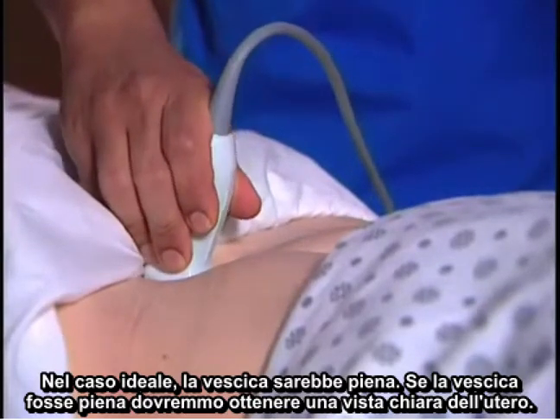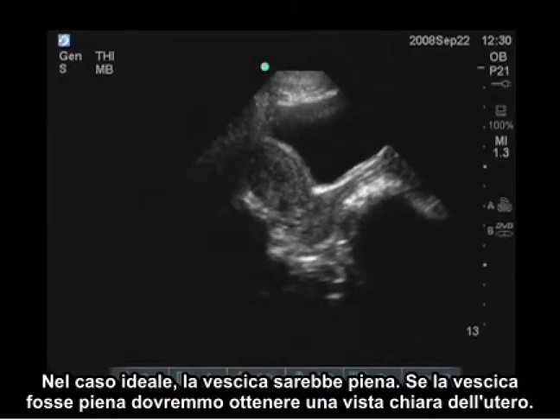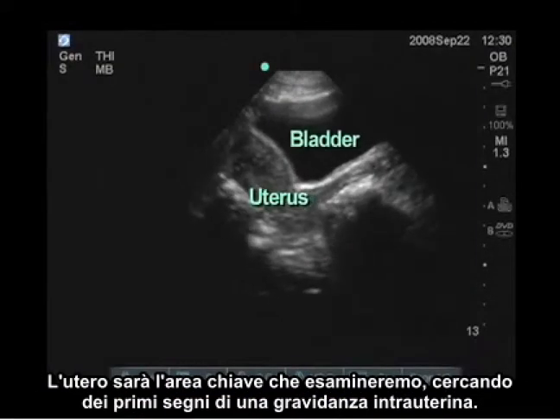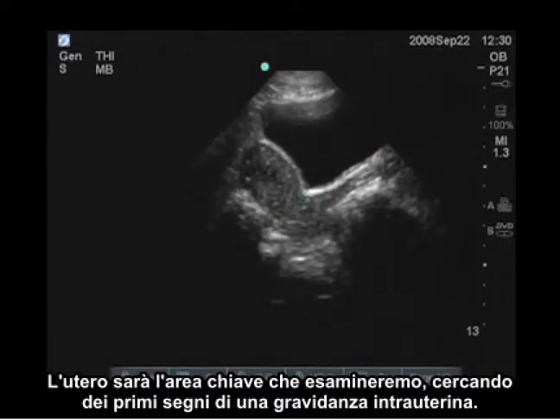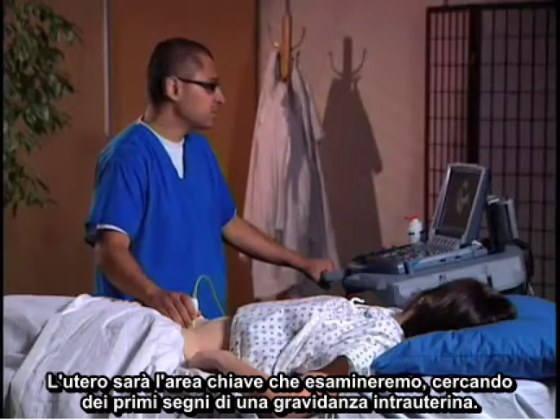Ideally, the bladder is full. If the bladder is full, we should be able to get a good view of the uterus. Through the uterus, it will be the key area that we're going to interrogate and look for early signs of an intrauterine pregnancy.